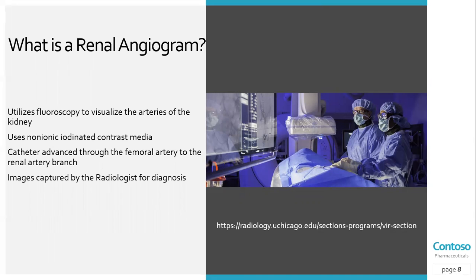the renal arteries within the abdominal aorta. The radiologist will inject iodine-based contrast dye through the catheter at points where the renal artery aneurysm is suspected, and the contrast dye then highlights the portions of the renal artery under fluoroscopy and is recorded to make an accurate diagnosis regarding the localization, type, and severity of the renal aneurysm.